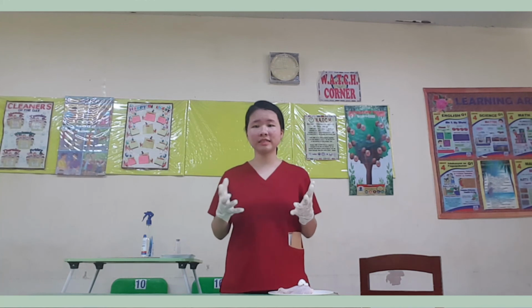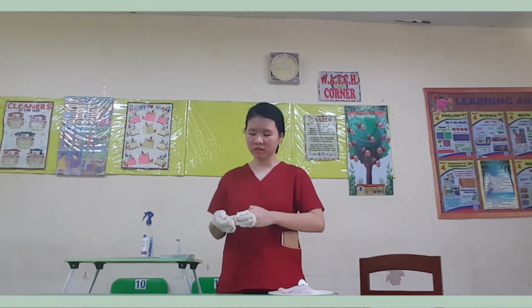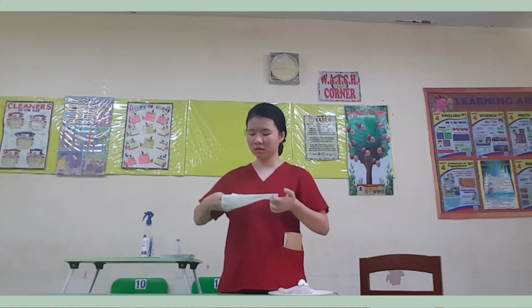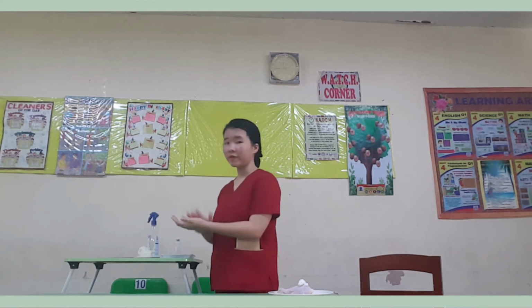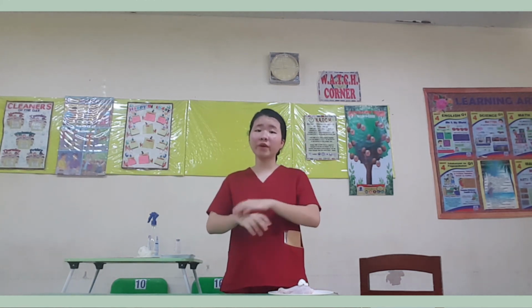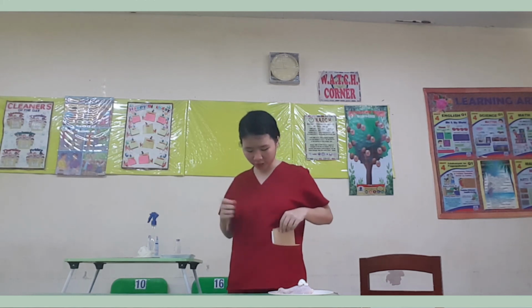And for the second to the last step, you need to remove your gloves. And apply alcohol-based hand rub for hygiene and to prevent contamination. And for the last step, you need to evaluate and document the care to monitor and record the progress of the patient.